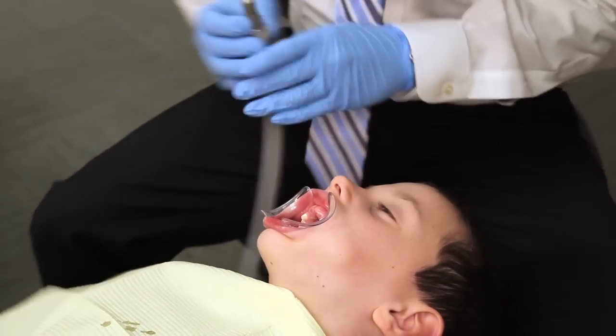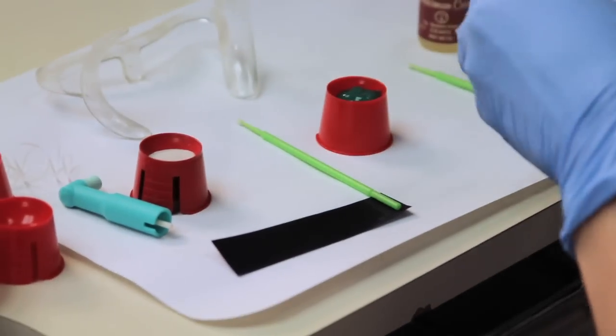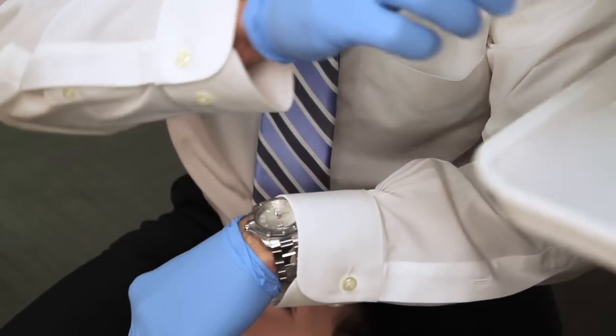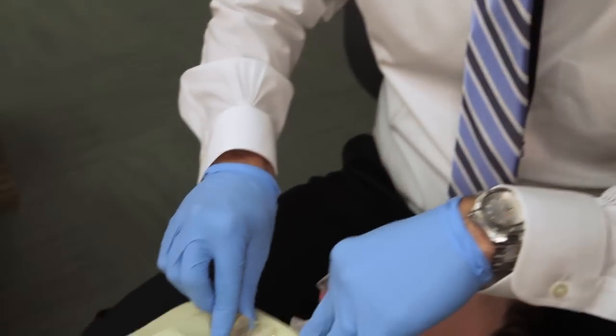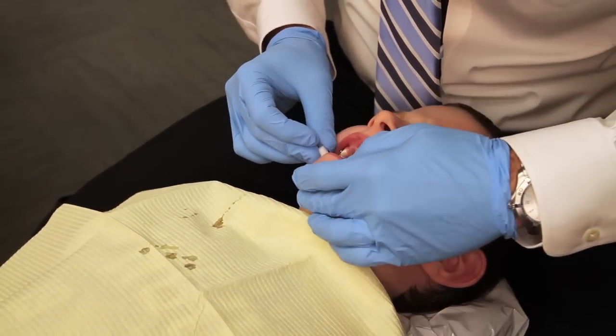Once the teeth are dry and the patient is opened wide, the patient manager will mix up the tooth adhesive. She will then hand the expander to the orthodontist and the orthodontist will insert the expander into the patient's mouth. Next, the patient will bite down onto cotton balls. This helps snap the expander into place.